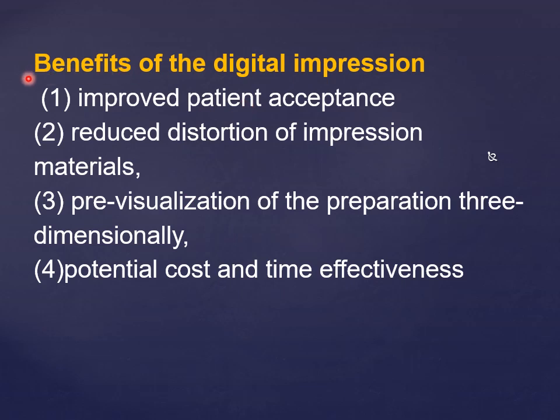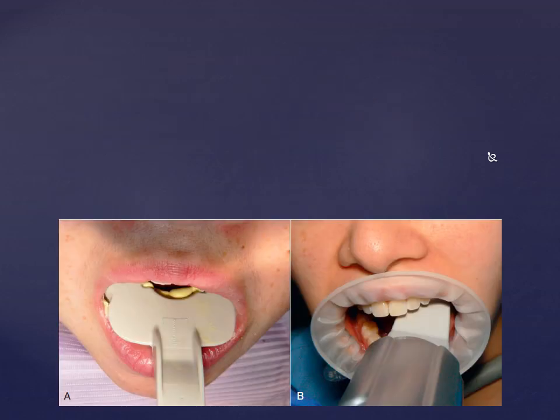The benefits of the digital impression: first, improved patient acceptance, reduced distortion of impression material, three-dimensional previsualization of the preparation, and potential cost and time effectiveness.